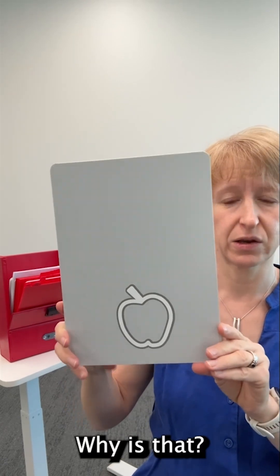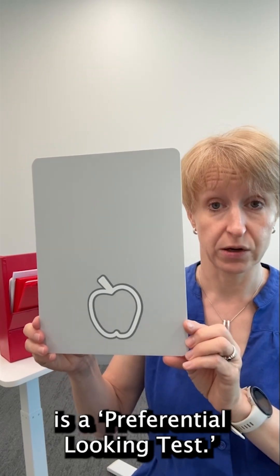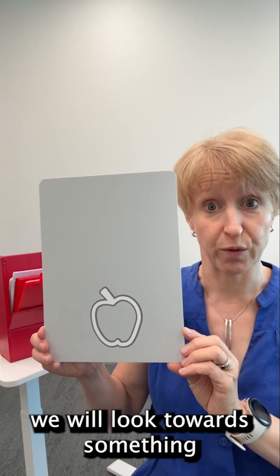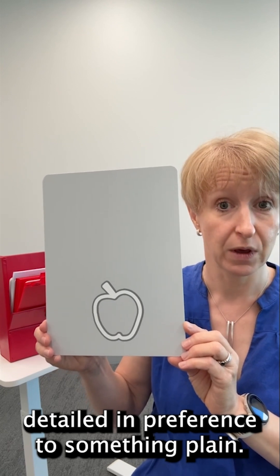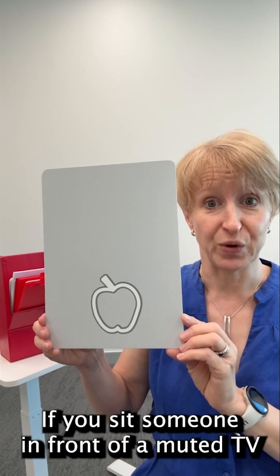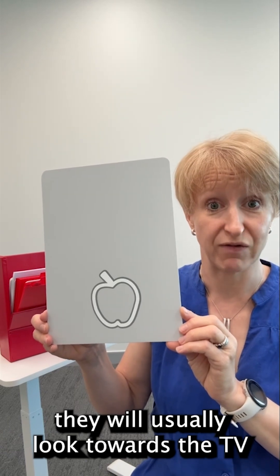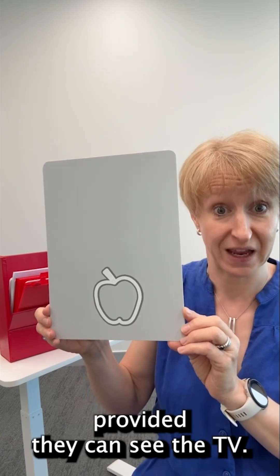Why is that? Well, this test is a preferential looking test. Preferential looking tests are based on the theory that as humans we will look towards something detailed in preference to something plain. If you sit someone in front of a muted TV mounted on a plain wall, they will usually look towards the TV rather than staring at the plain wall it's mounted on, provided they can see the TV.